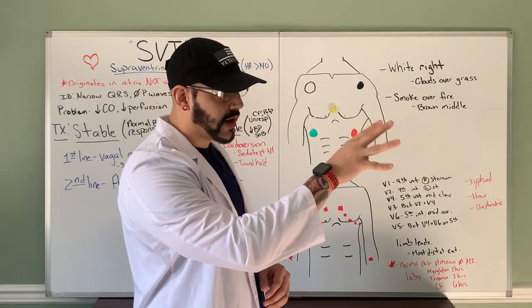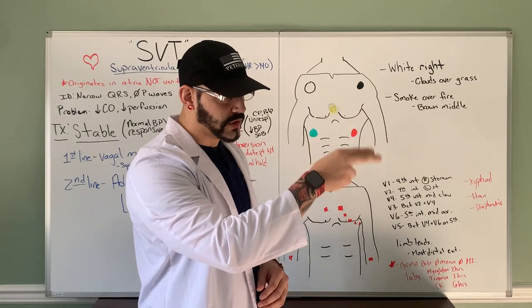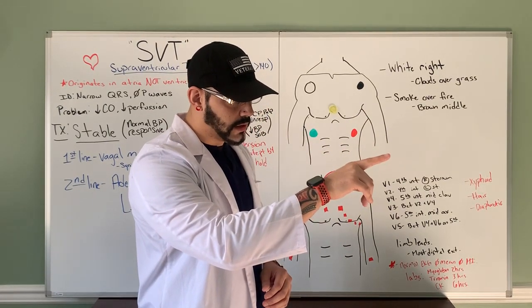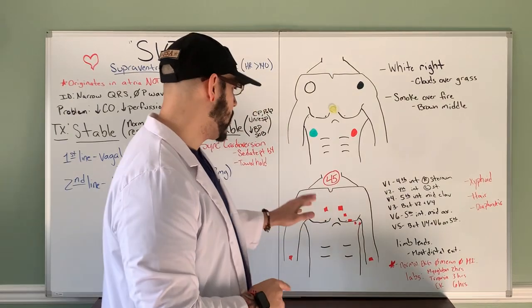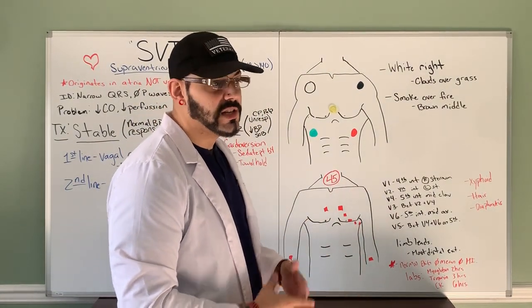and then in the top right corner, you're going to have your little three circles. You're going to have your red circle, your yellow circle, and your green circle, right? Once all those circles start to get moved over to the right and the green circle starts to light up, that means you're good to go. You're solid, okay? Just ensure that your patient is not moving around too much while trying to get this EKG because you're going to get artifact.